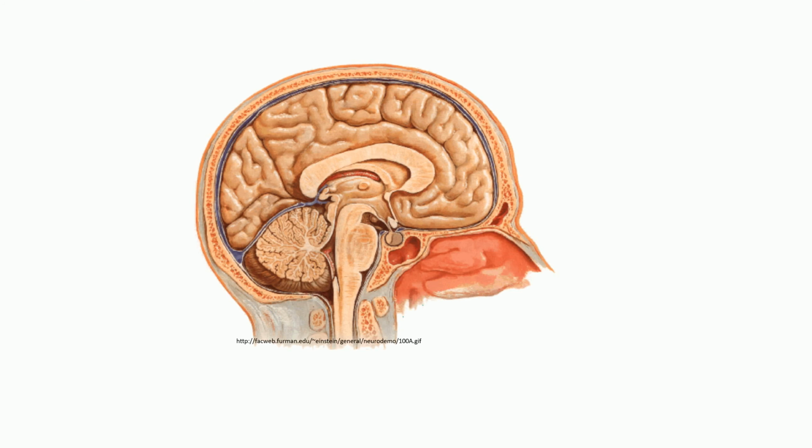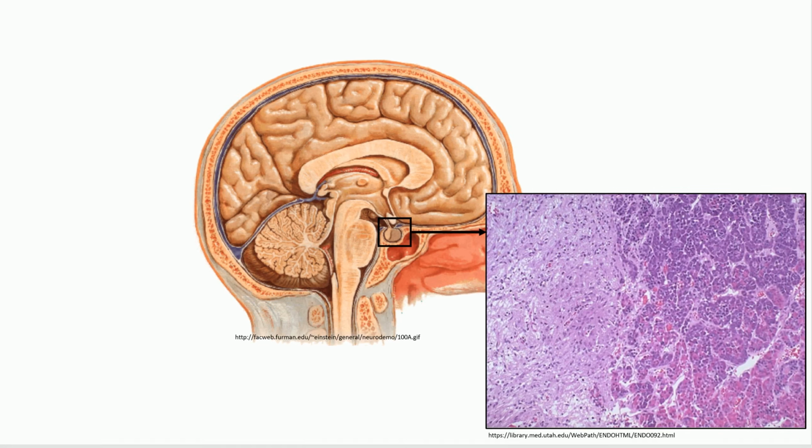Okay, if we continue on, our next focus is going to be the pituitary gland. The pituitary gland looks very different if you're thinking about the posterior versus the anterior pituitary gland. Remember, the embryologic origin of the pituitary is very different for the posterior and anterior portions. The posterior portion of the pituitary gland represents a projection off of the hypothalamus embryologically, whereas the anterior pituitary gland is actually a gland that arises embryologically from the hypophyseal pouch or Rathke's pouch.